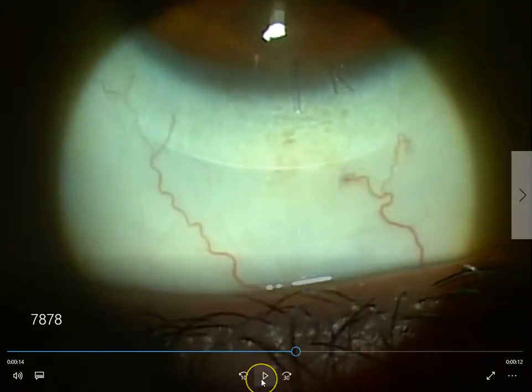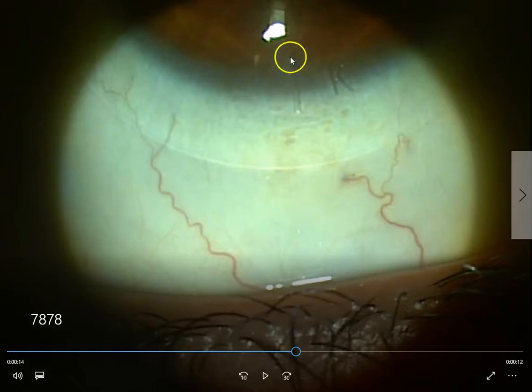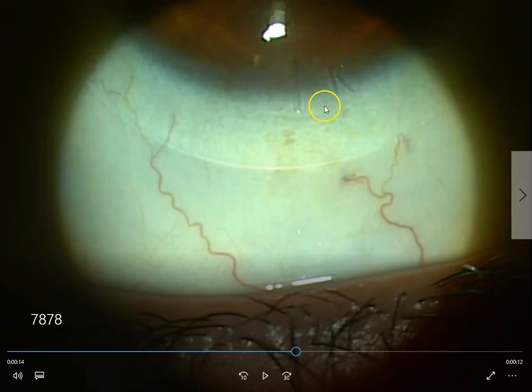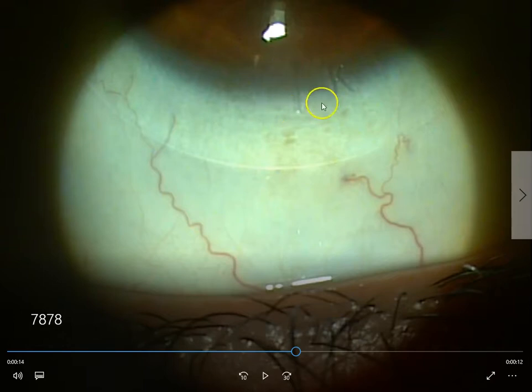Another thing that we look at in toric lenses particularly is that the orientation mark has to be perfectly vertical, or as close to vertical as possible. In this lens there's a little bit of rotation to the right, and you can see it here — the rotation is towards the right. The other thing that we look at is movement.